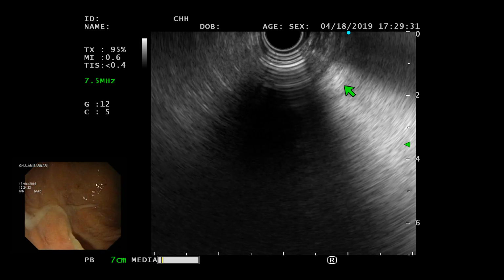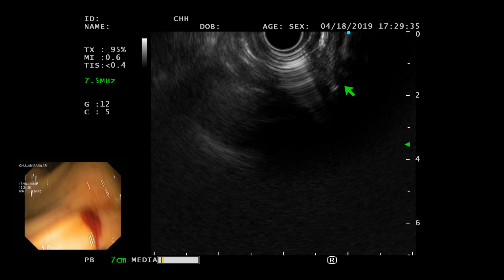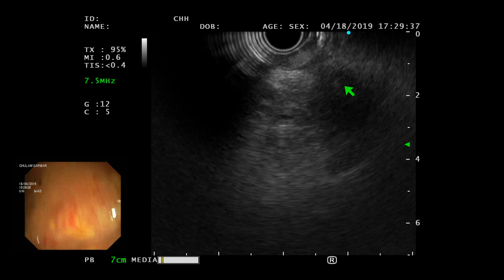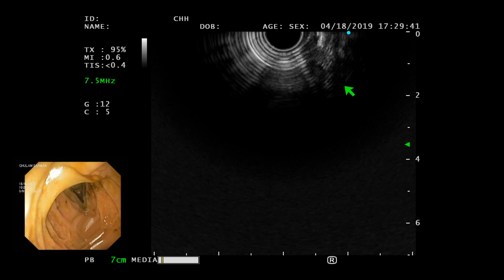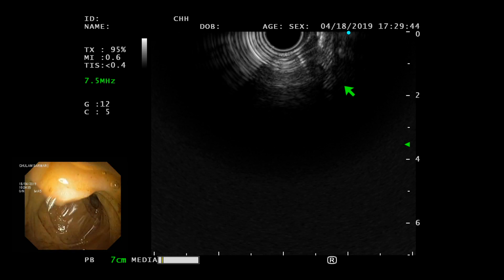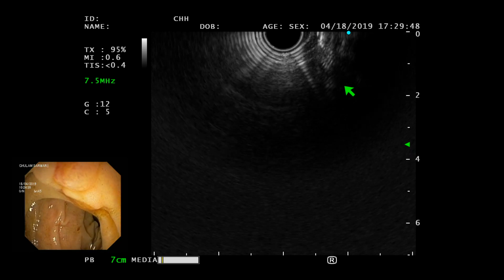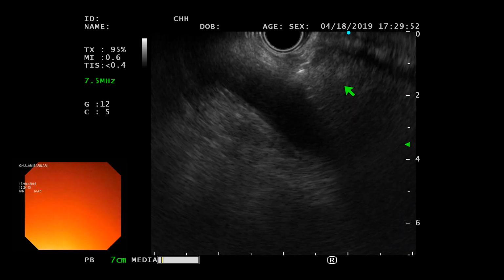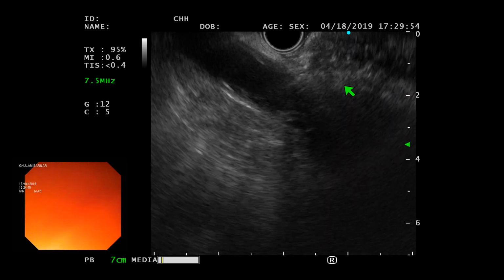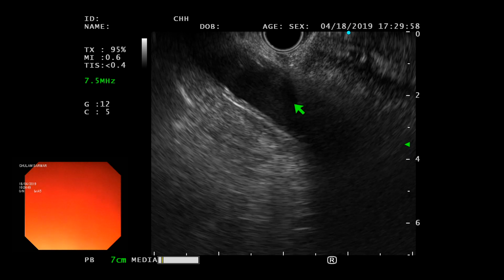His bilirubin is close to 12 to 13. So obviously there is some cholangiopathy there. There is an obstructive pattern. Now coming back to the bile duct I showed you, I couldn't follow that completely all the way to the ampulla, but here I can see it better from D2, which I already have seen before.